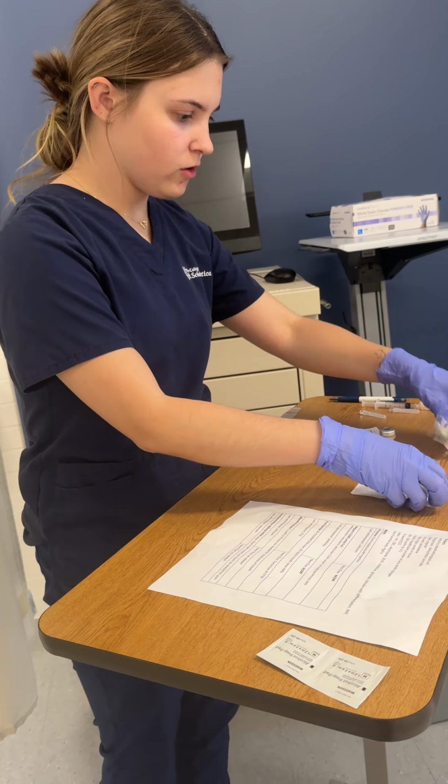For obese people, we would think about using a 1-inch needle and possibly a 90-degree angle, and we'd want to go under their little flab of fat that they have. And then I did it for the first one, but you're also going to clean the top of this for 15 seconds and then let it air dry for a second.